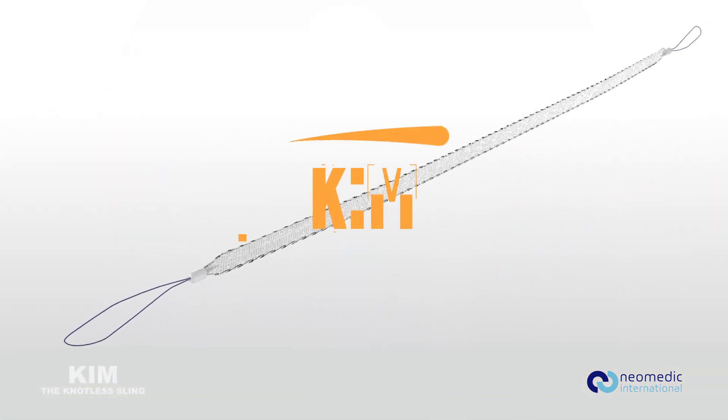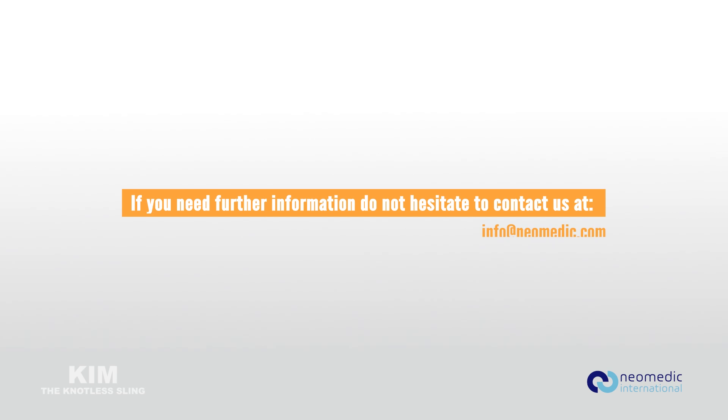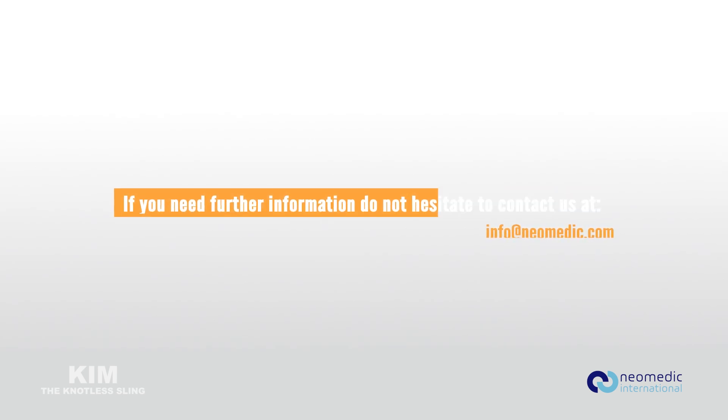The continent sling — another Neomedic unique design to improve results. For further information, contact us at info@neomedic.com.